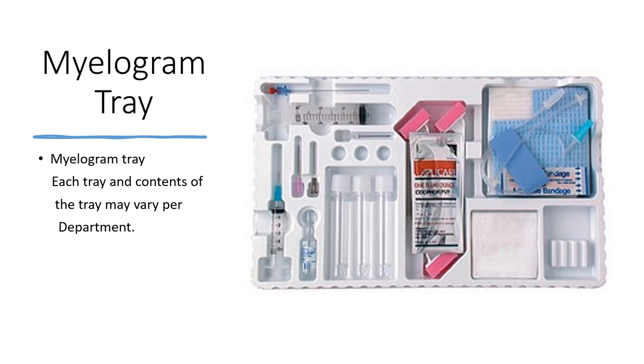Here is an example of a myelogram tray. Each myelogram tray may differ from department to department. It depends on what brand or what type you order. Some doctors use all of the contents in here, and some only use one or two pieces. So it just depends on what your facility prefers.